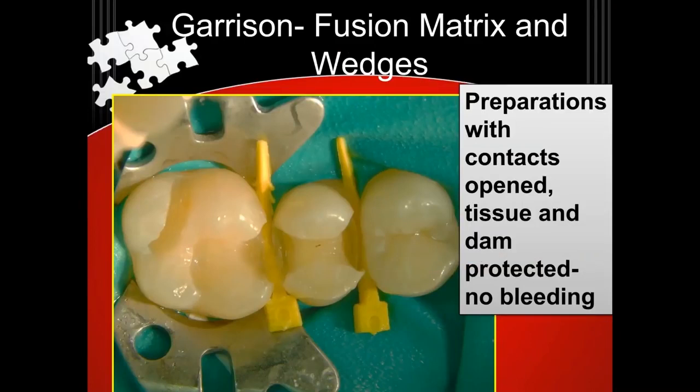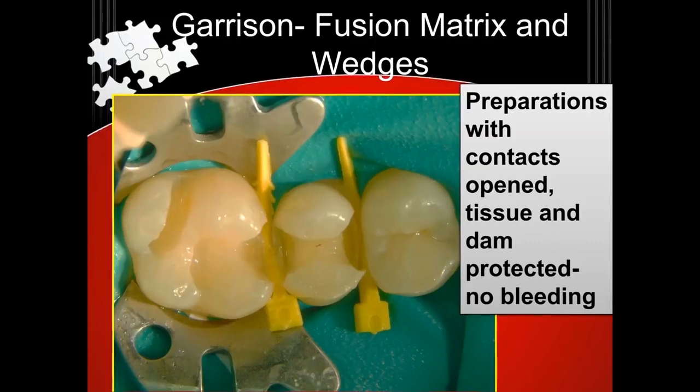Man, you can see things so well, can't you? It looks straight down, you can see things. There's no bleeding, there's no salivary contamination. That's a way to do dentistry. And it takes me maybe 30 seconds to a minute to put a rubber dam on — it is super fast. And to do the pre-wedging takes, like, seconds.